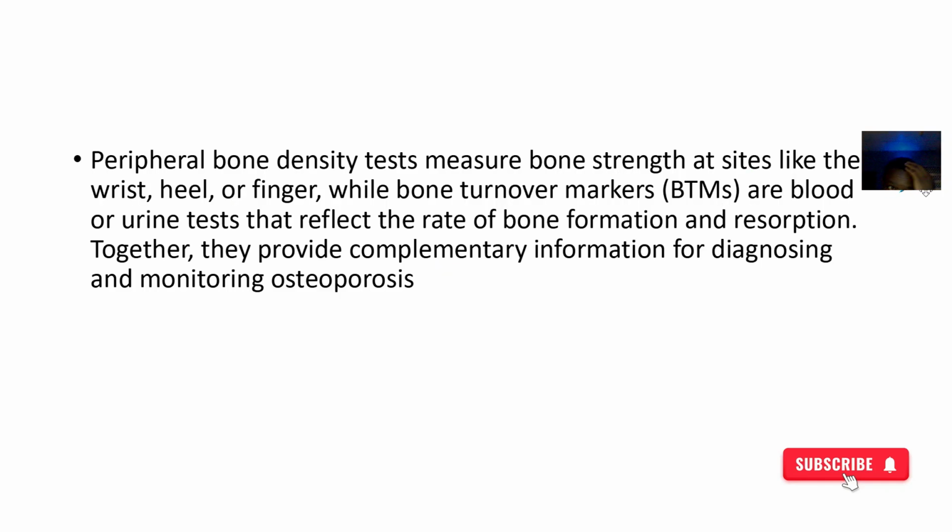The strength of bones at places like the wrist, the heel, the finger. While the bone turnover markers, you mainly see them in urine or blood. Do you understand? Those are trying to reflect the health of the bone.